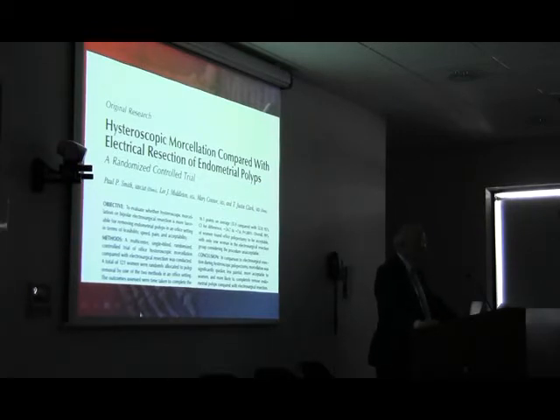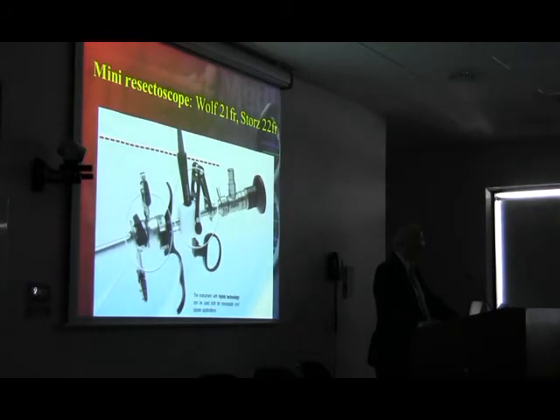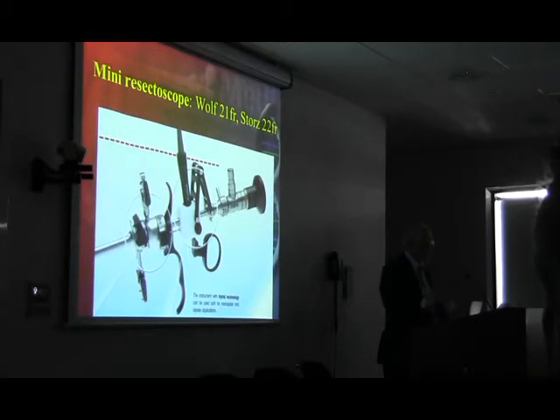You're going to mention that a bit in your talk as well, aren't you, Dave? Okay. So what's the alternative if you want to take out some fibroid or polyp in our outpatients? Several of the companies have produced smaller resectoscopes. Now you look at the 21 French Wolf and 22 French Storz. So this is maybe just small enough. This 21 French is the equivalent of 7 millimeters. You can use that as an outpatient gadget, but you're going to have to use local anesthetic. But it's possible to use these.